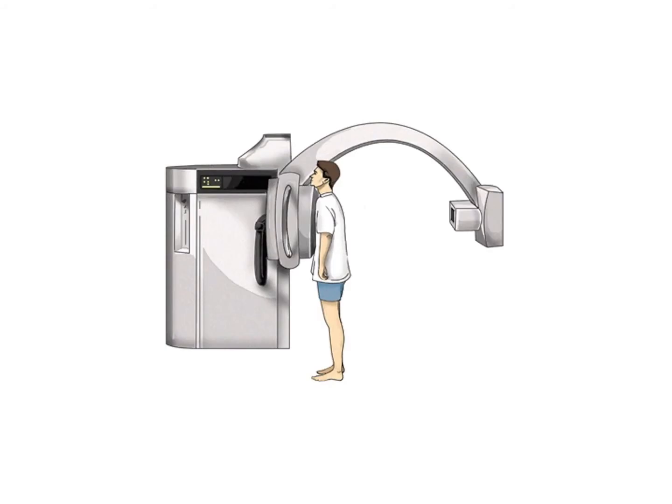So this is just a quick view of what an X-ray machine looks like. If you're going down to radiology, a lot of the times we see patients in the ICU and even on the floor where they do a portable chest X-ray, where they bring a big portable unit and take the picture right there as the patient is sitting upright in the bed. Ideally, if you can get them out of the bed standing, they get a better picture, but it depends on the patient's condition.